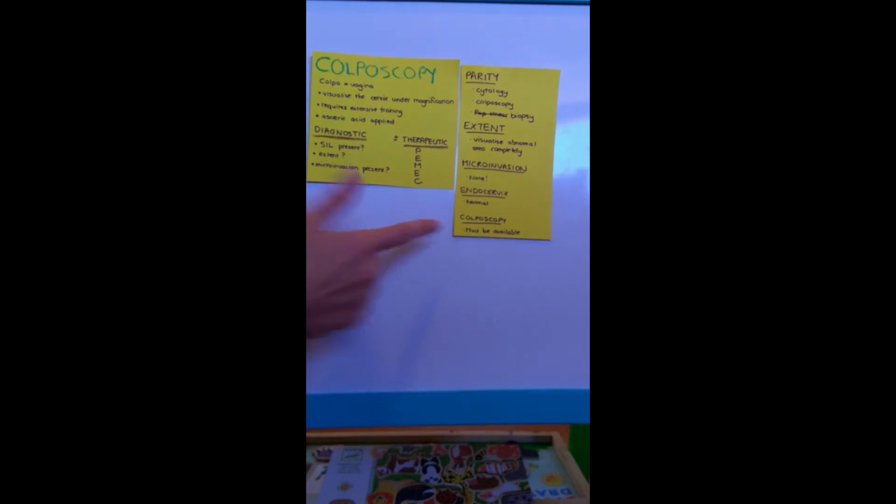And colposcopy must be available. If you don't have colposcopy, then of course you cannot use any therapy during colposcopy. That might sound silly, but there are lots of places in the country where colposcopy isn't available, and in those cases you will not be able to treat during colposcopy. You'll have to go straight ahead to a cone biopsy.